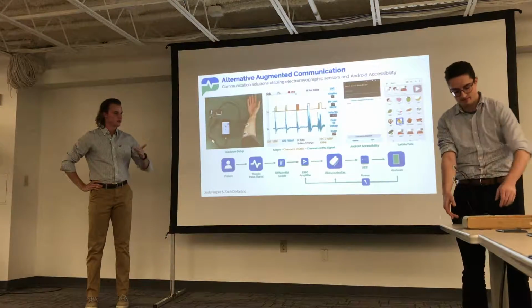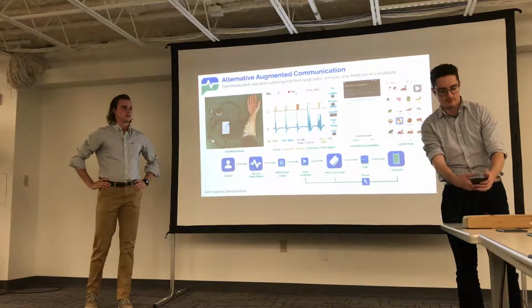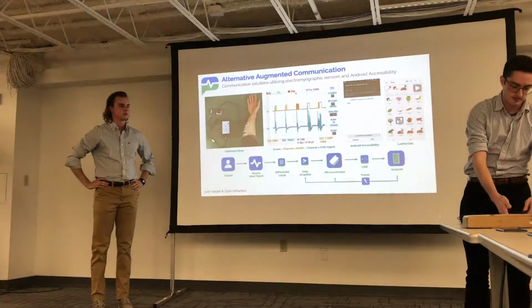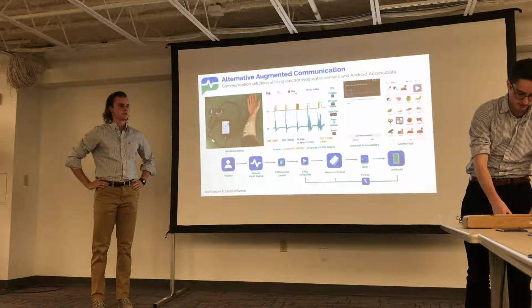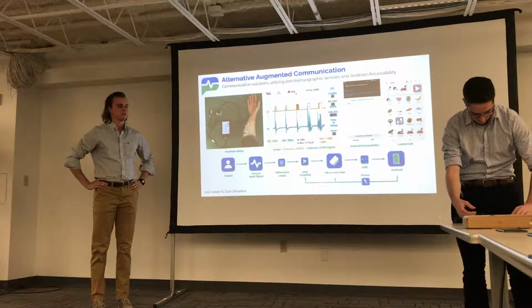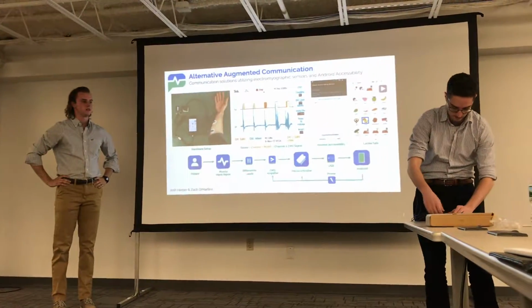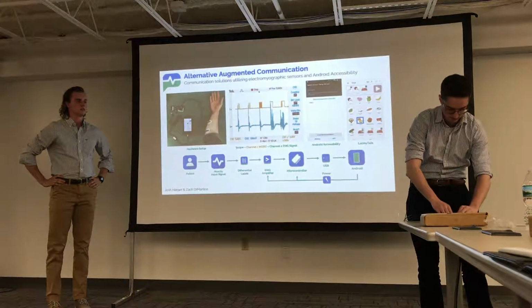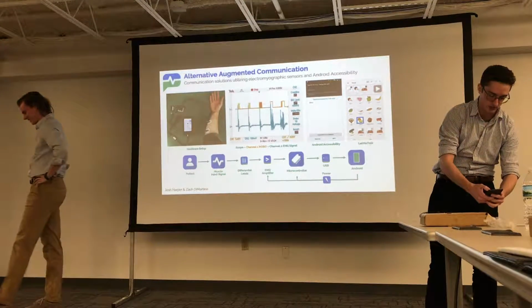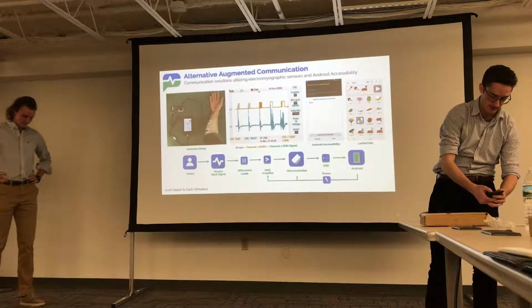And that's all I got here. He's going to show you a quick demo. All right, so it's pretty much plug and play. It's going to power on. Oh, hold on. Android has some weird settings with USB stuff.